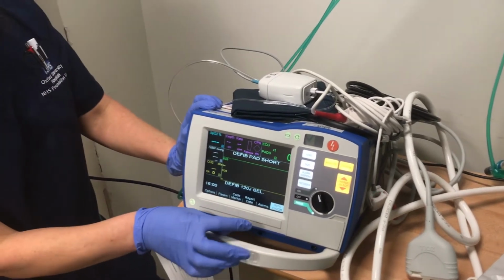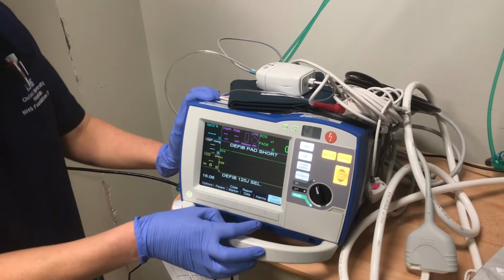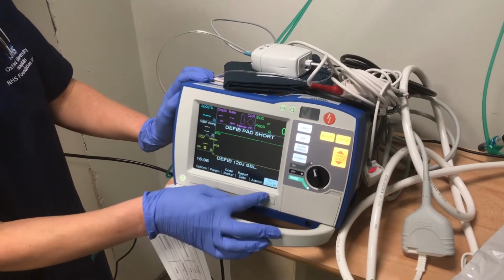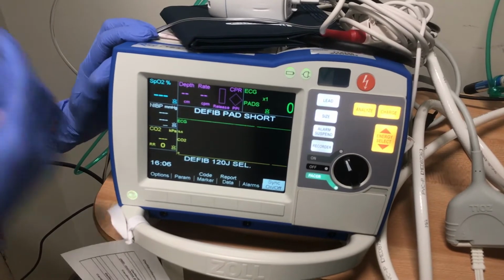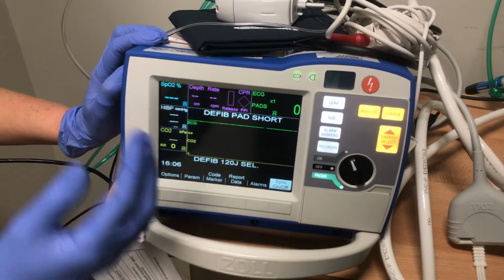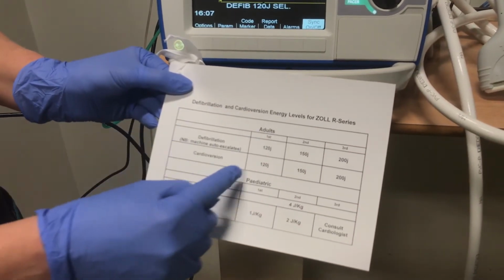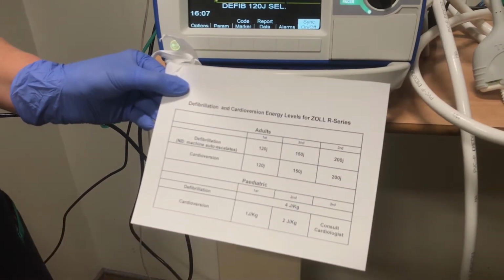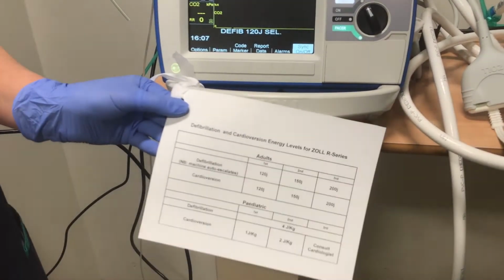If you do want to deliver a DC cardioversion, then you can press this. The sync button is here, and you would do it in the same way, where you would select your energy, you would charge, but it does again increase the energy. For the cardioversion, it should increase incrementally by itself as well, but again, you can do that by the energy select buttons.